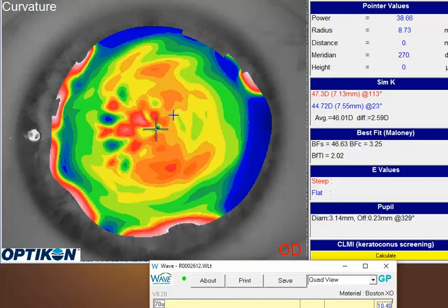There are two ways to address this to try to get a little bit better data out of this cornea. When you're first opening up a lens to design, WAVE gives you the option of averaging or not averaging the astigmatism. In this particular case you could choose the average amount and that will help smooth out some of these areas.